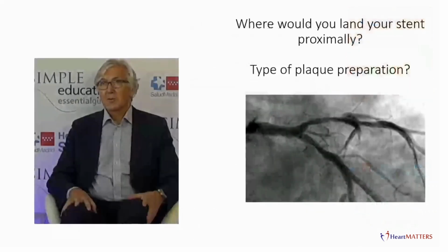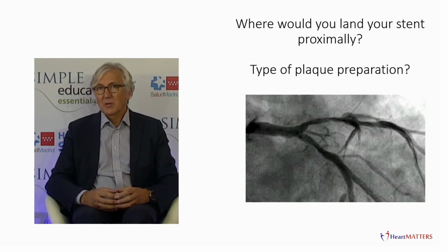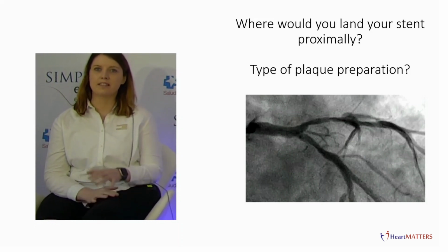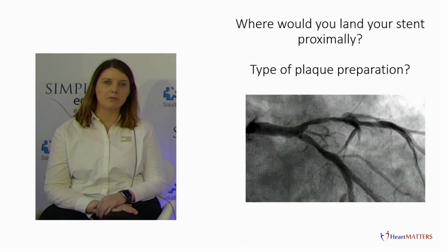Let's start with the second, because Brita, in the course, is going to speak about the role of imaging in the management of calcific stenosis. Well, Angela McKinley, sorry. So Brita, would you like to comment on this particular topic? What would you do? I think the nodule of calcium is quite eccentric, so we need to take that into account. So I think this possibly is a good case for lithotripsy. I think Shockwave could be useful in this case, just to get an optimal result. So that's something to consider here.